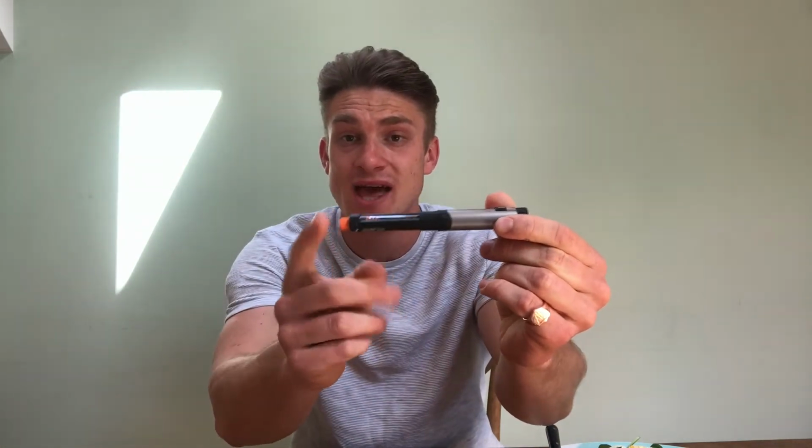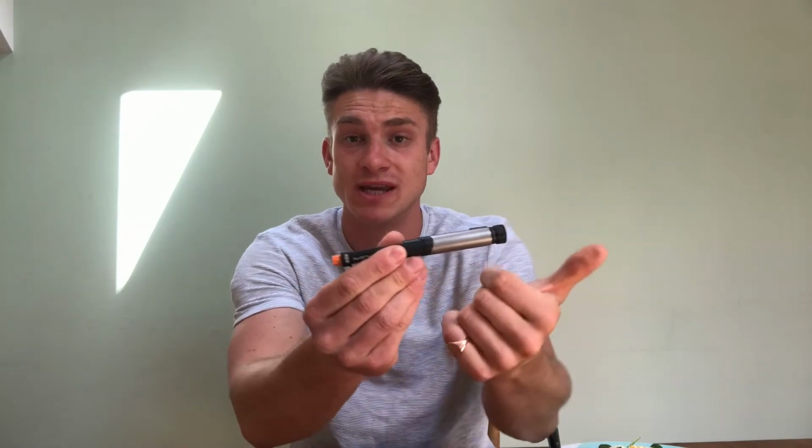Now people do that through syringes, people do that through insulin pens, putting a needle on the end, dialing up how much you need and putting it into the skin. Others use insulin pumps, which is what I use. As a diabetic, if you don't put the right amount of insulin into your body to the amount of sugar that you have eaten, your levels are going to rise and rise and rise, and that's really dangerous.